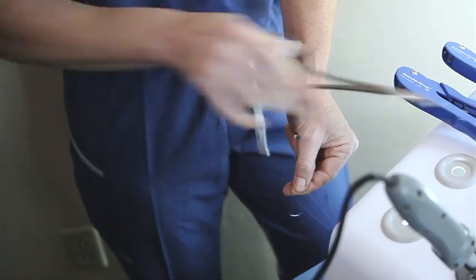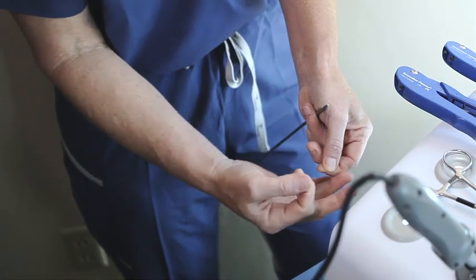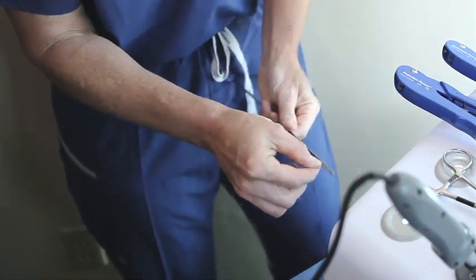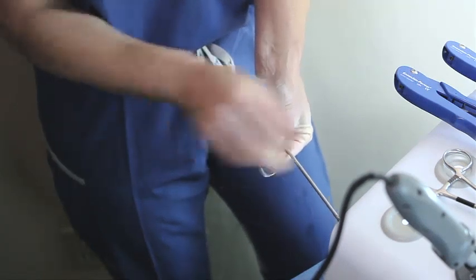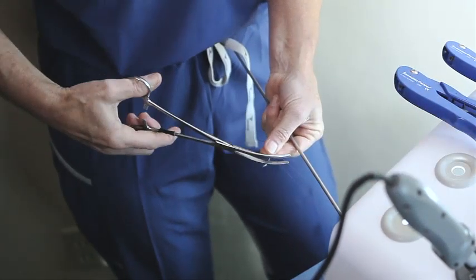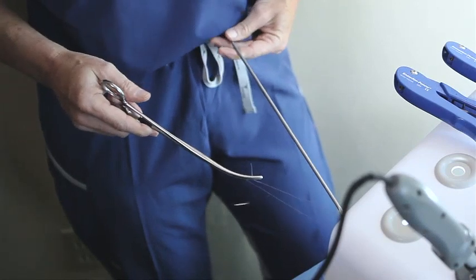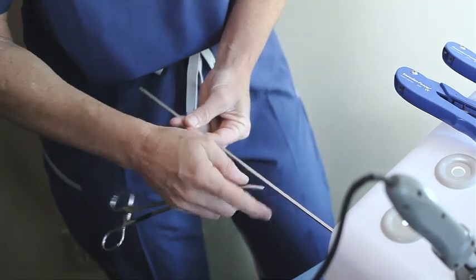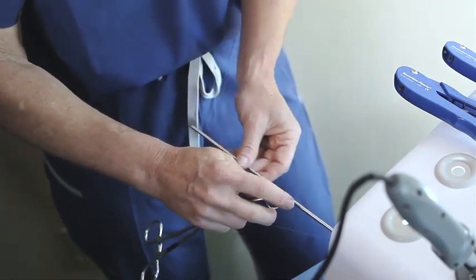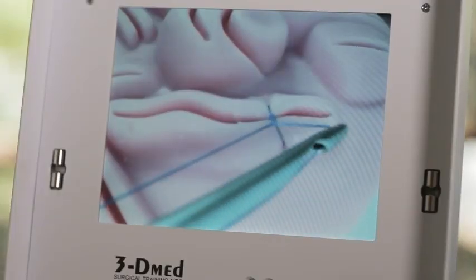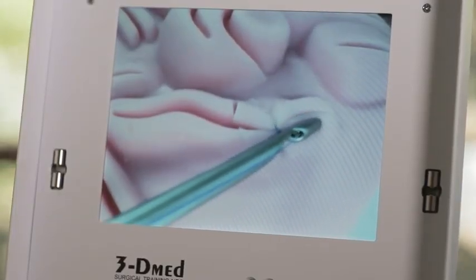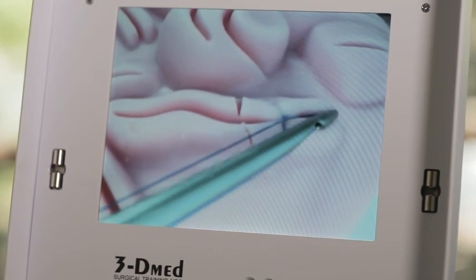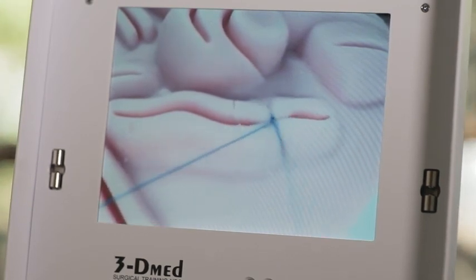Outside of the body, I will do a one-handed knot because we already have our surgeon's knot in position. I will use my hemostat—you'll probably use a smaller hemostat in real life—and pull the knot down. Now in this situation, I will toggle both ends of the suture. Here you can see we're tightening the knot nicely. So in this situation, the knot puller pulled the knot in and we've got it tied down nicely.